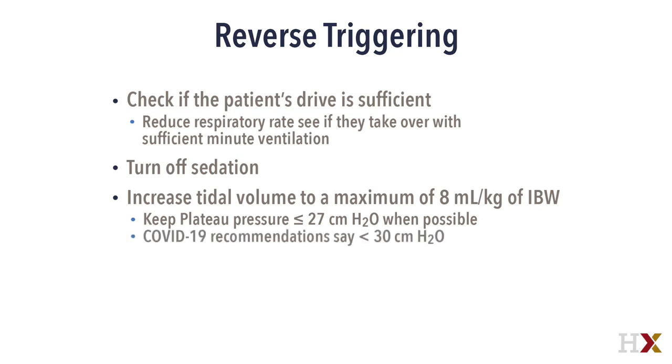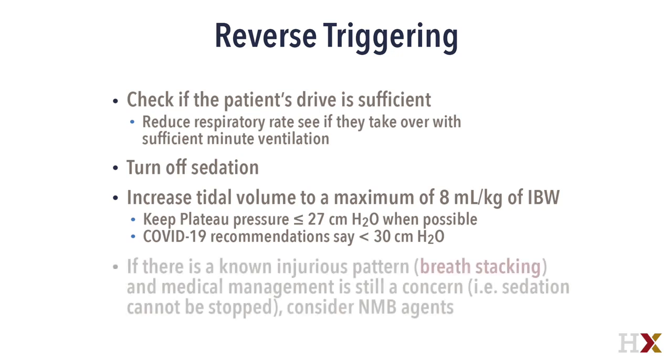Now, in COVID-19 patients, the recommendations are to follow those of typical ARDS guidelines, which is to minimize or limit plateau pressure to less than 30 centimeters of water. Now, if there is a known injurious pattern and you cannot correct reverse triggering, and the injurious pattern I'm speaking of is breath stacking, for example, and if medical management is still a concern, in other words, you cannot turn off sedation, then consider the use of neuromuscular blocking agents to protect the lung and minimize the possibility of barotrauma.